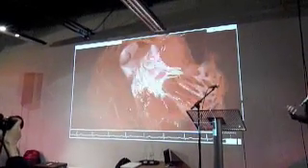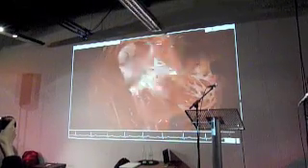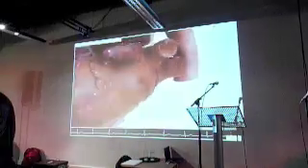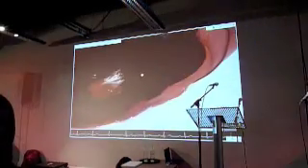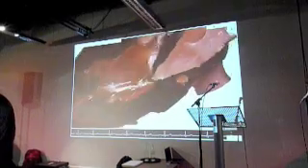continuity between the two. The level of detail of the anatomy had to be good enough to convince heart surgeons of what they were seeing. So hence the 2 years of painstaking work to try and get it to this stage. Even now, we wouldn't claim it was perfect, but it is by far the most accurate there is in the world.